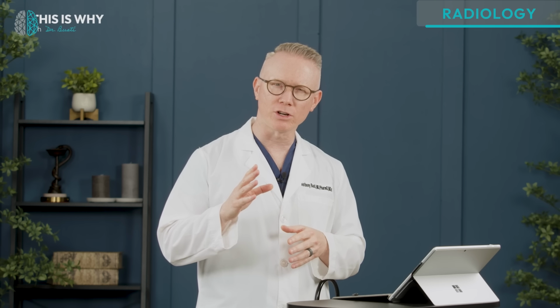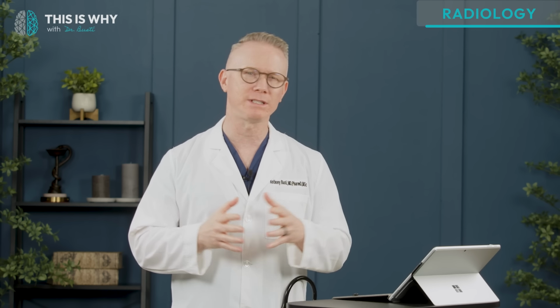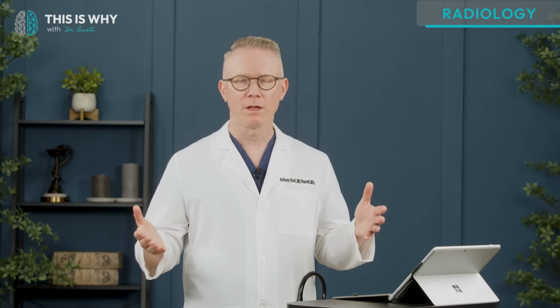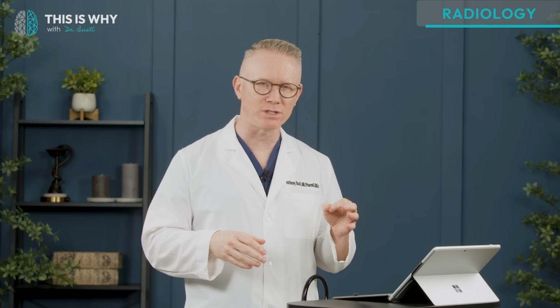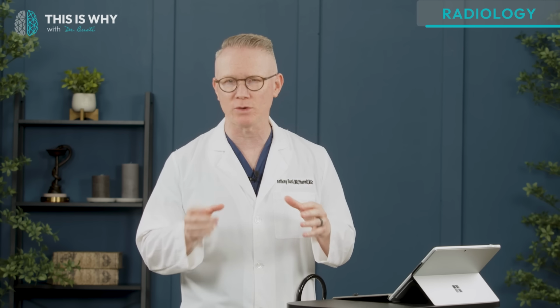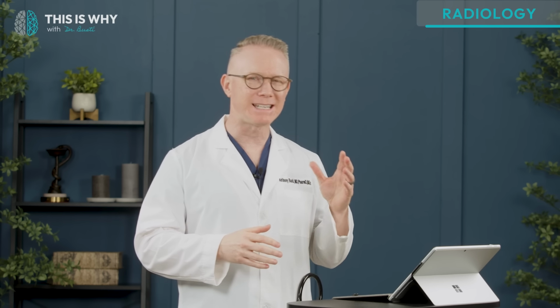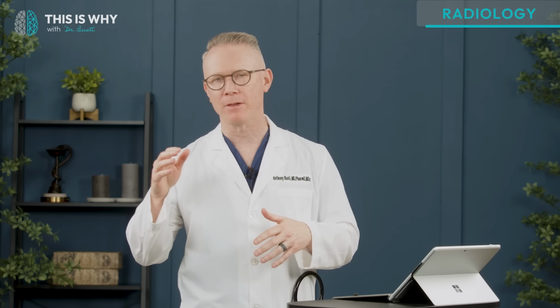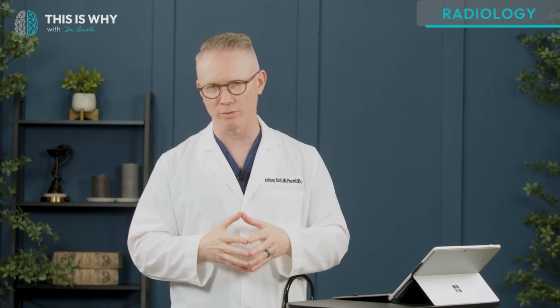Okay, so our first question is, why should you learn how to identify and count ribs on a chest x-ray? Well, as a healthcare professional, mastering rib identification and counting on a chest x-ray is essential for assessing the image quality, detecting abnormalities like rib fractures and hyperinflation, and using ribs as landmarks to localize abnormal findings such as pneumothorax or even tumors.